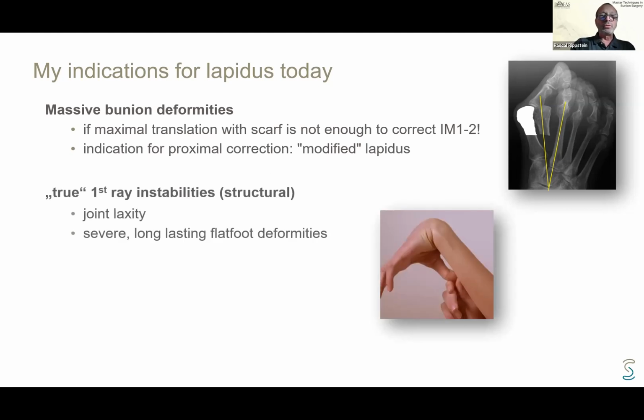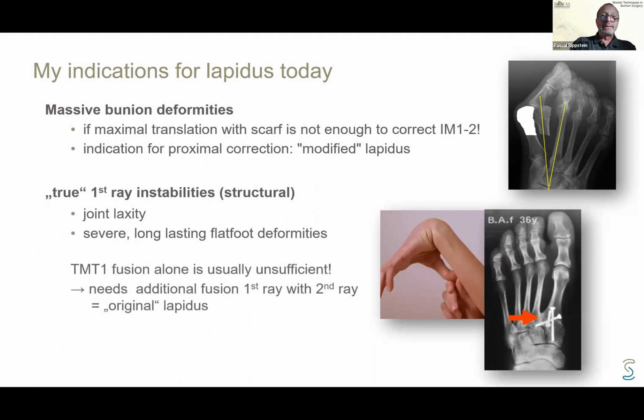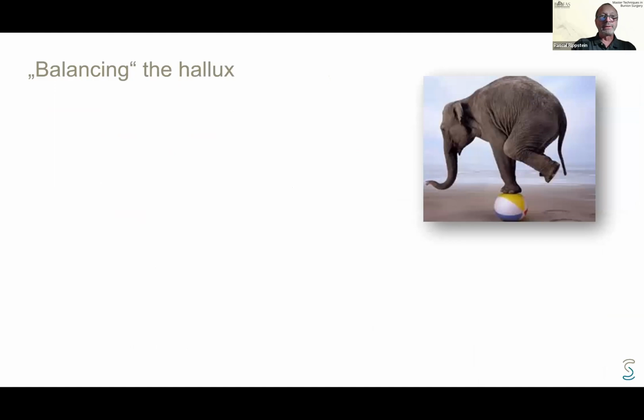Now, I also use the Lapidus for the true first ray instability. These are structural instabilities. They are due to a joint laxity or sometimes because of severe long-lasting flat foot deformity. In those cases, however, you have to realize that the TMT1 fusion alone is usually insufficient, and you will need to stabilize the first ray to the second ray, which is very stable. That's actually the technique which has been described by Lapidus. This is the original Lapidus. This I perform nowadays only in about 10% of cases.